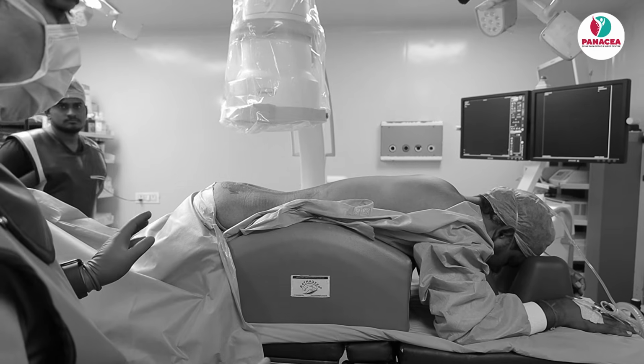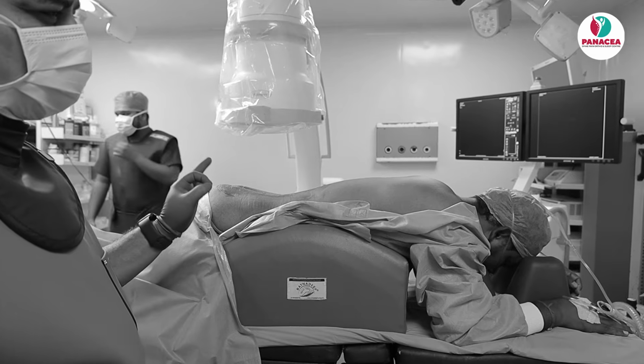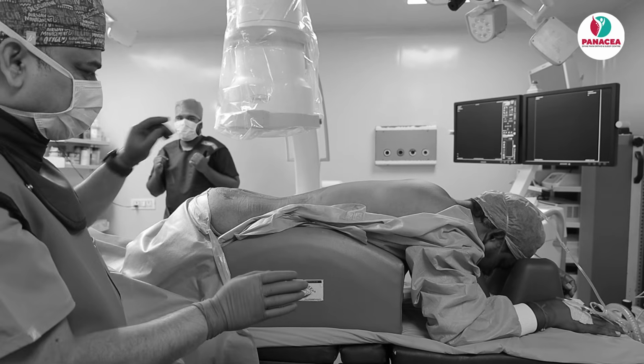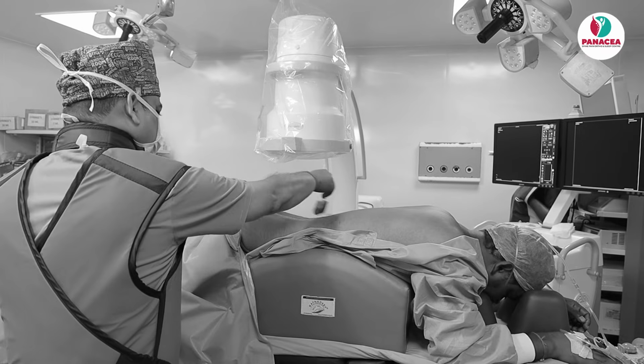Now this patient has got left side symptoms, so we are going to do a subpedicular or supraneural safe triangle approach of transforaminal epidural injection. So this is the head end side, this is the tail end side, this is the right side, that's the left side, and the patient position is this way. The intervention site is nicely scrubbed.